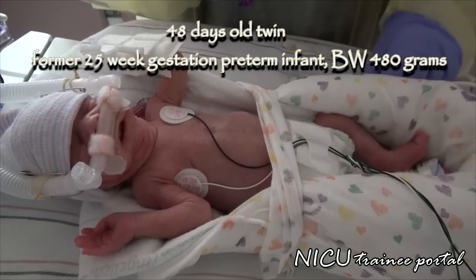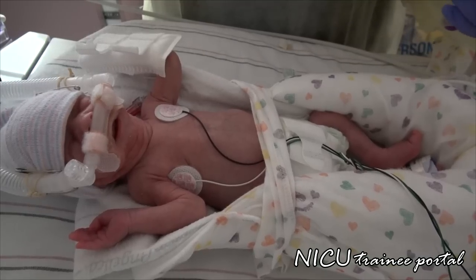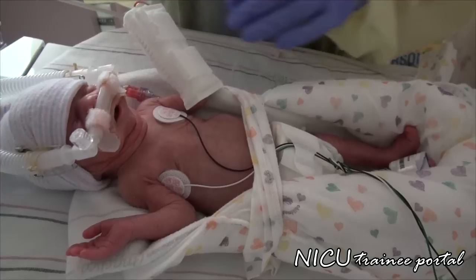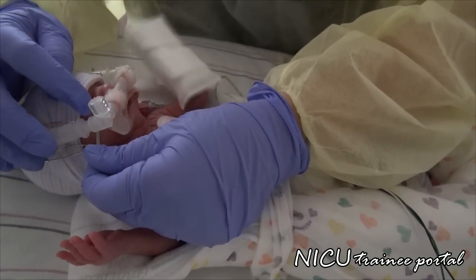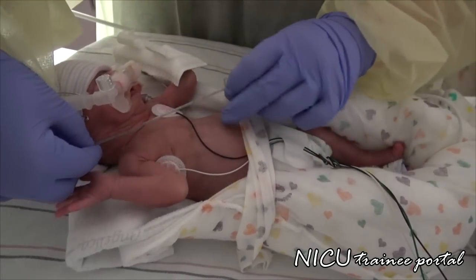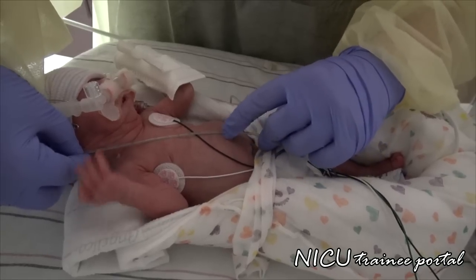We're going to put a new orogastric tube in — the infant pulled his out. There are 3 methods to measure: nose to earlobe to xiphoid process, nose to earlobe to umbilicus, and nose to earlobe to the midpoint between xiphoid and umbilicus. We're going to use the third measurement. From the edge of the nose to the earlobe is 6 cm for him. The xiphoid is at 15 cm and the umbilicus at 21 cm, so we're going to go to 18 cm.